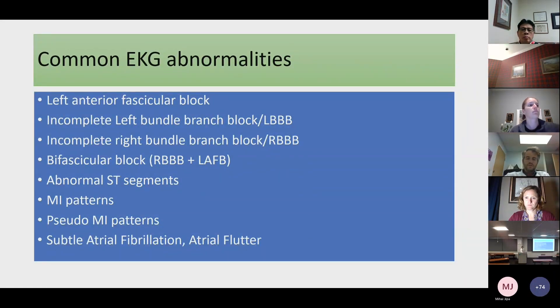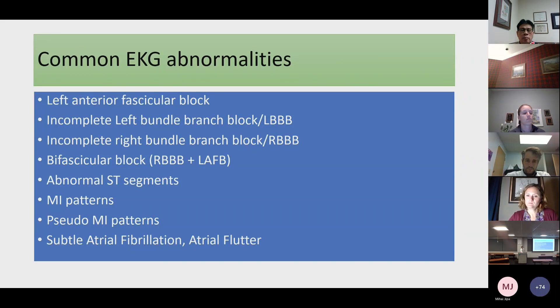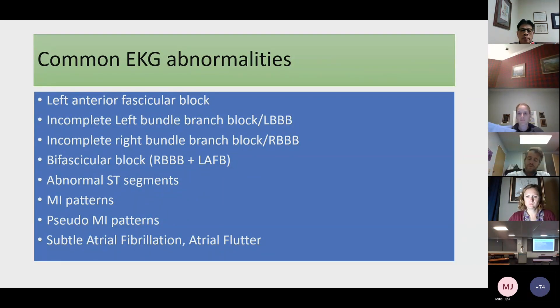We'll look at two or three examples of each finding and then talk through a summary slide. The abnormalities include left anterior fascicular block, left bundle branch blocks — incomplete and complete — right bundle branch blocks, bifascicular block, which is almost always right bundle branch block plus left anterior fascicular block, abnormal ST segments, MI patterns and pseudo-MI patterns, and subtle atrial fibrillation and atrial flutter — how to pick that up and why it matters.